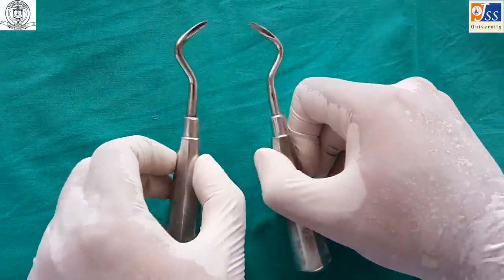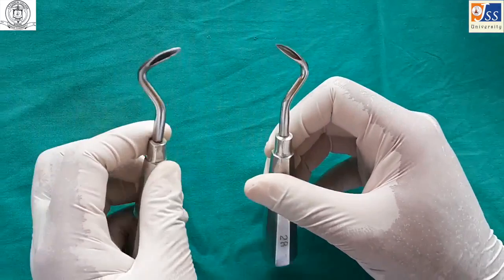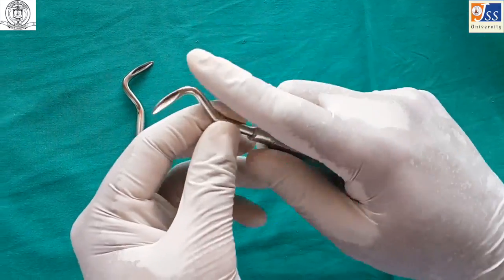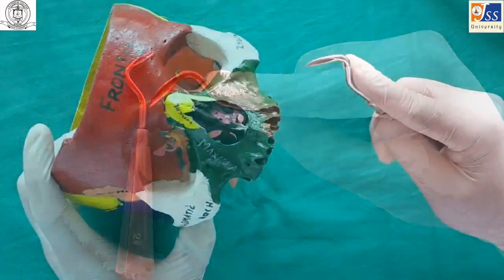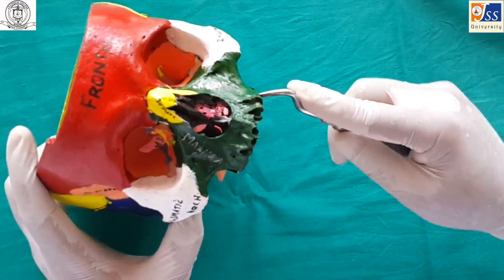The Apexo elevator is a paired instrument, held in a palm and thumb grasp. It is used for the removal of fractured root tips or apices, and is primarily used on the wedge principle.